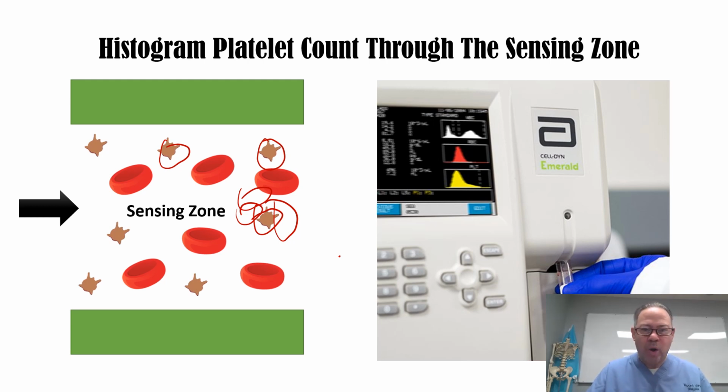So, cuando uno no hace la inversión correcta y agita o agita demasiado, las plaquetas se ponen juntas, se aglomeran juntas y ahora tienen el tamaño de un glóbulo rojo. ¿Y qué tú crees que la máquina va a decir? La máquina va a decir, este tiene otro glóbulo rojo, pero la plaqueta te va a dar un conteo menor. Y ahora dice que tú tienes una trombocitopenia o una baja en plaqueta. ¿Y eso es lo que tú tienes? No. ¿Eso fue un error de quién? Del flebotomista o de cualquiera que sacó la sangre y no siguió los protocolos.